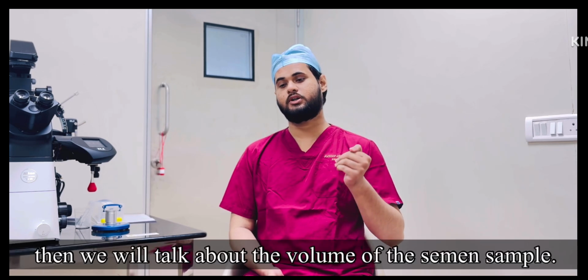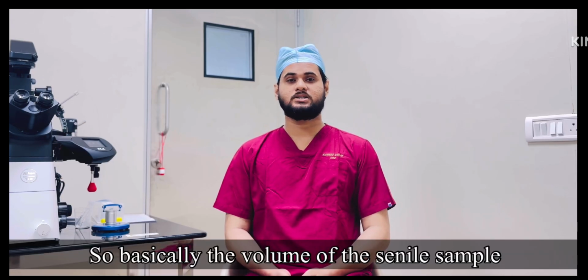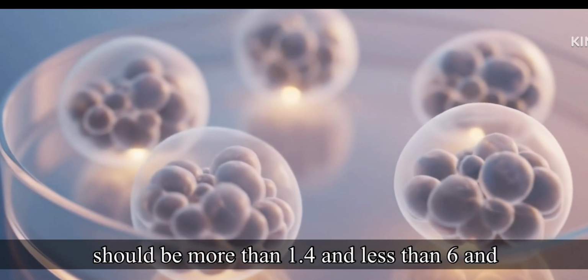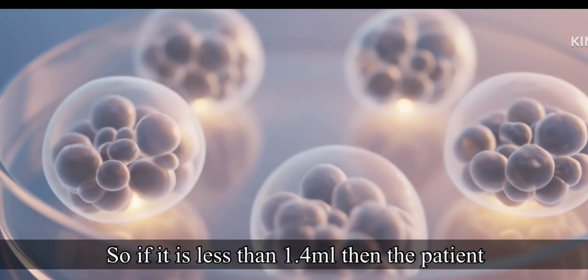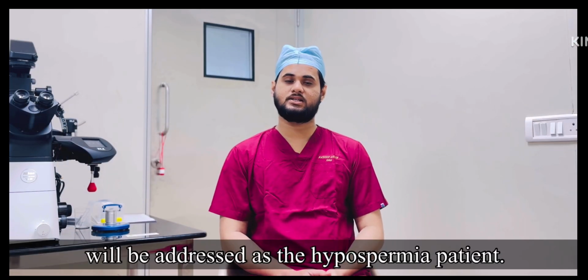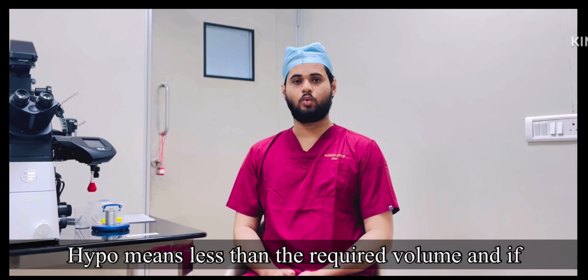Then we will talk about the volume of the semen sample. The volume should be more than 1.4 and less than 6 ml. If it is less than 1.4, then the patient will be addressed as a hypospermia patient. Hypo means less than the required volume.